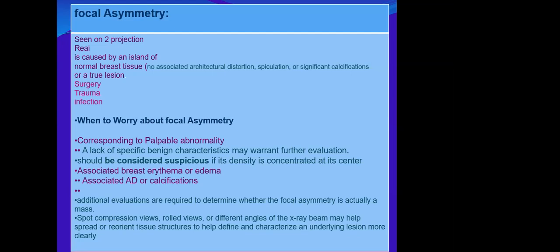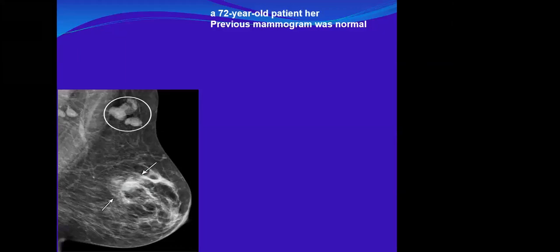Then we have to consider it as a suspicious finding, and we have to proceed, do ultrasound, or if it is not seen on ultrasound, use another modality to do biopsy. And what about this?